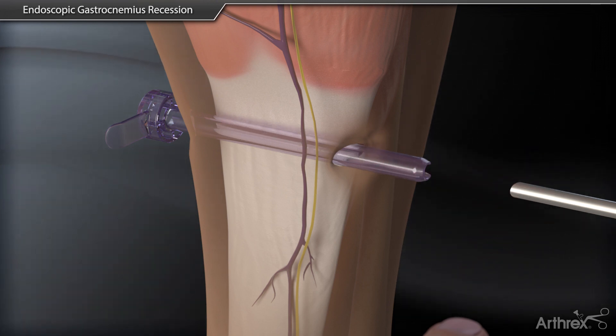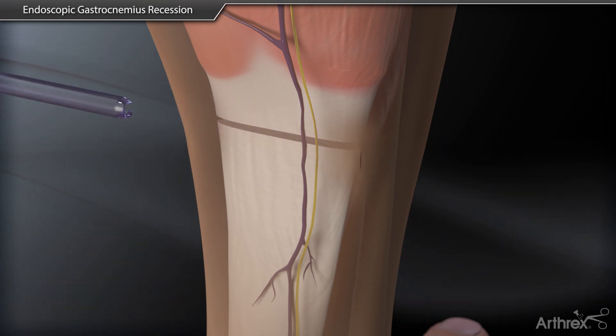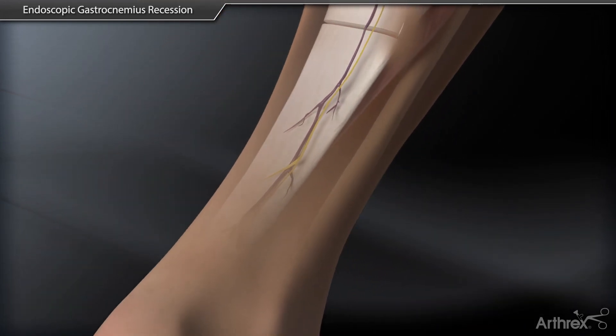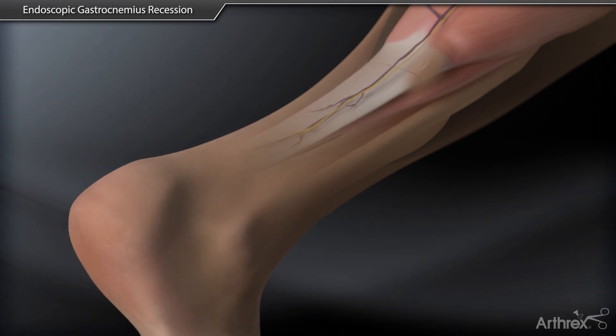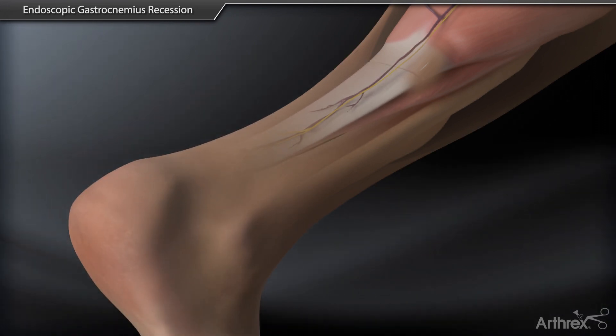At this point, the instruments can be removed. Passively dorsiflex the ankle joint to demonstrate improvement in ankle motion. The portals are then closed using sutures or steristrips.